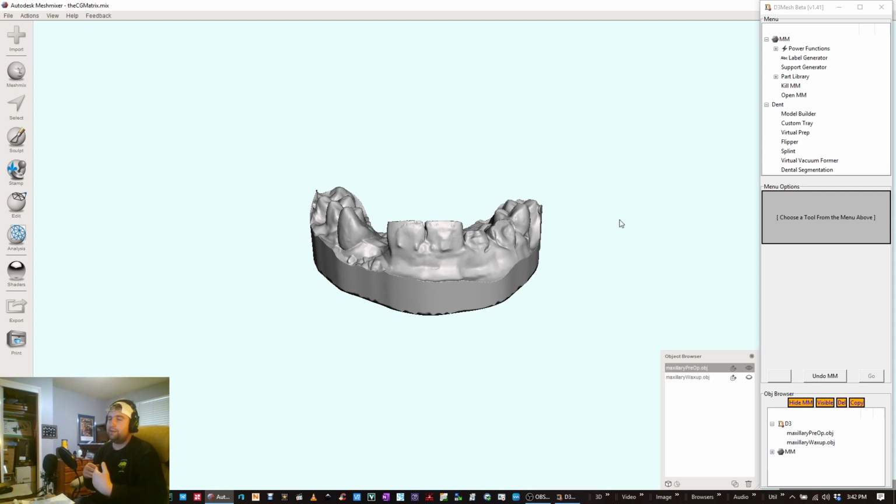and as it turns out, I think, because he did a little bit of a follow-up on it, the aesthetics and the fairly moderate-term prognosis of this thing was pretty good. They weren't chipping, they weren't cracking, they weren't breaking, and again, this wasn't supposed to be a final treatment, but it was more to get this patient into the proper occlusion, and to get a trial run for how things were going. And it was just amazing.